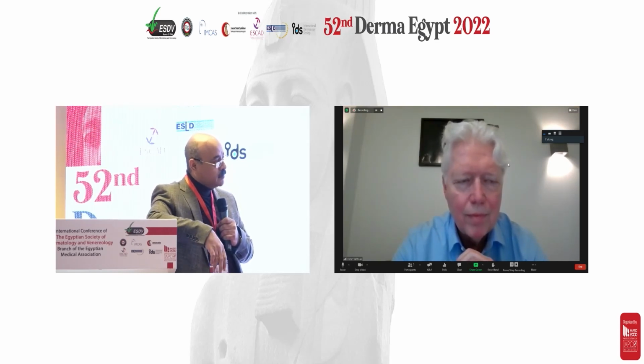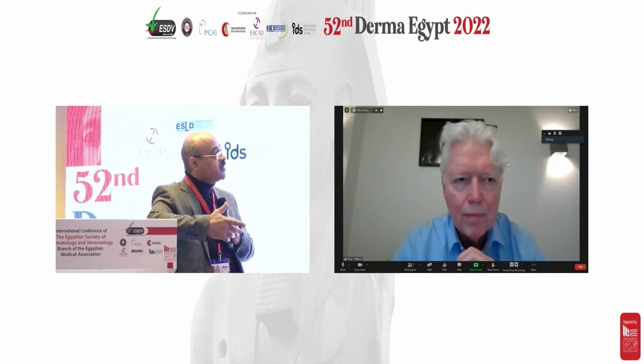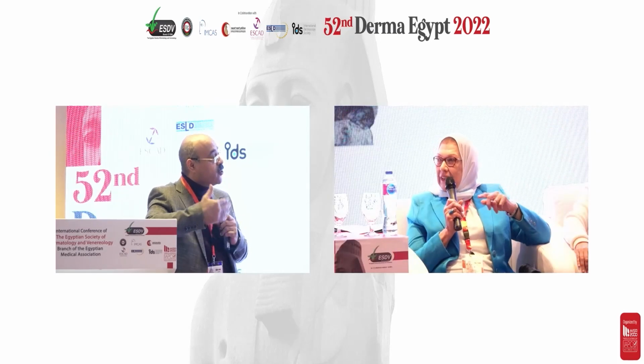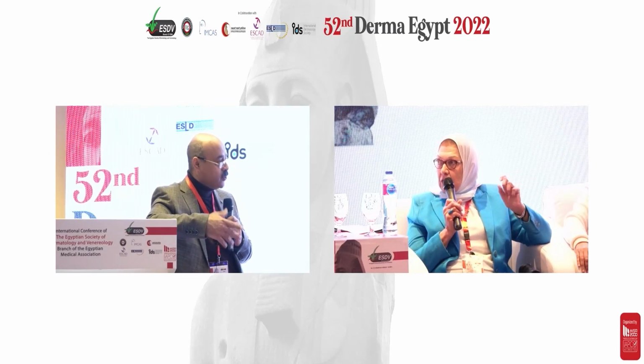If it is early stretch marks, yes, we can use pulsed dye laser and give excellent results. Okay, how many sessions? How many sessions, Dr. Mona? According to the effect. So you go on with three sessions or four sessions? Three or four sessions.